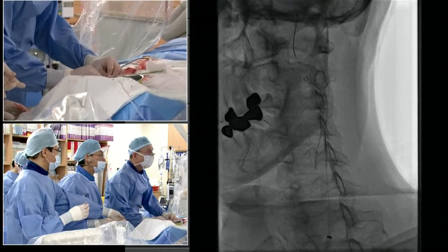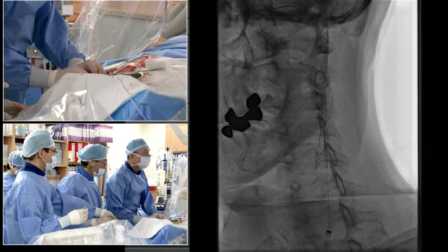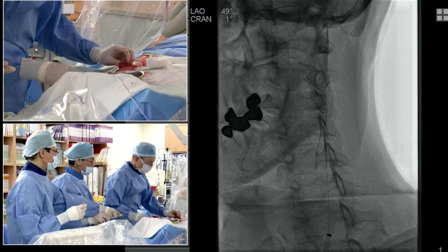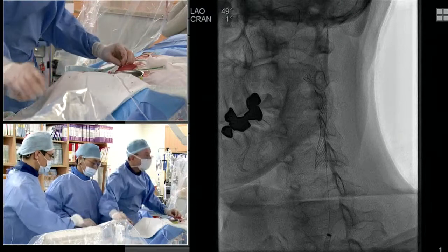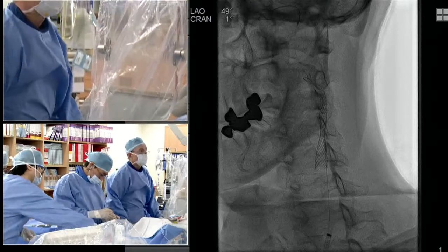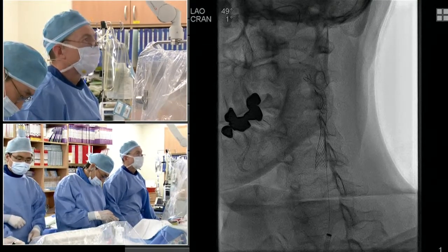There is some calcification over here. I think the wall stent's a good idea here. Yeah, so there's kind of mild calcification, certainly not severe. And there was just enough tortuosity that I thought that the wall would kind of smooth that out. But I think any stent here would probably perform pretty well, as you pointed out. It's not a particularly tough lesion. And although there is a big bend at the lesion, there is not excessive tortuosity distal to that point.